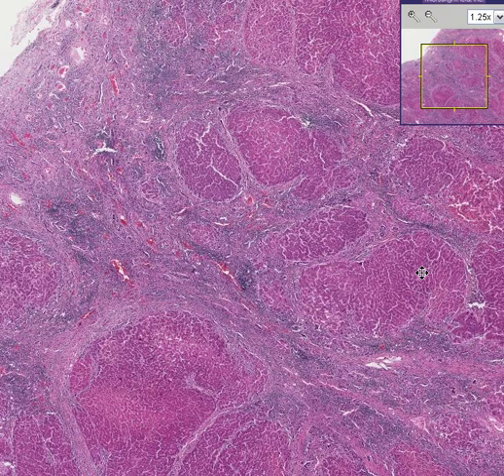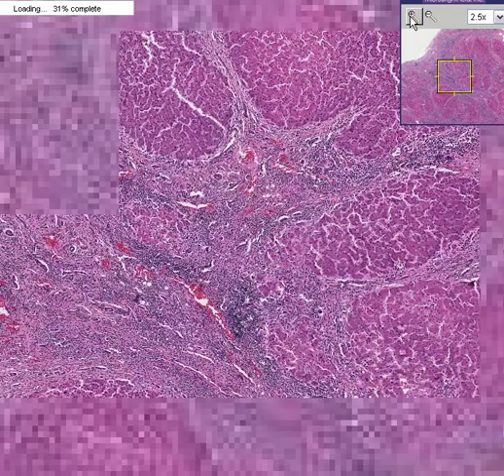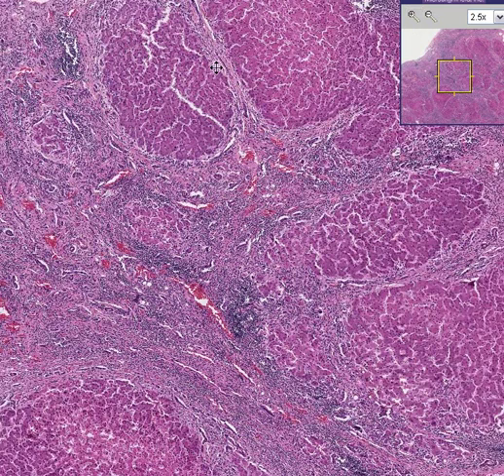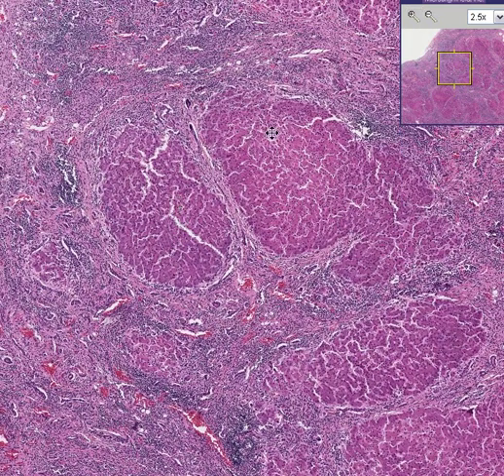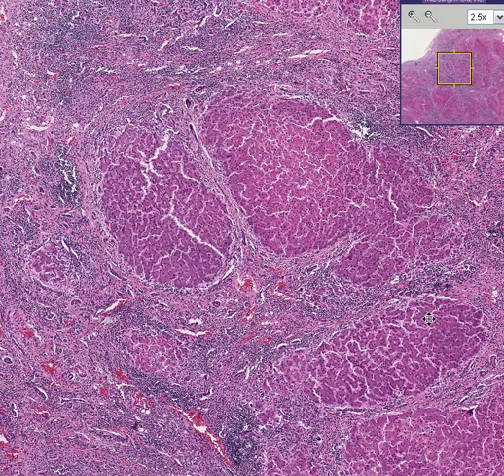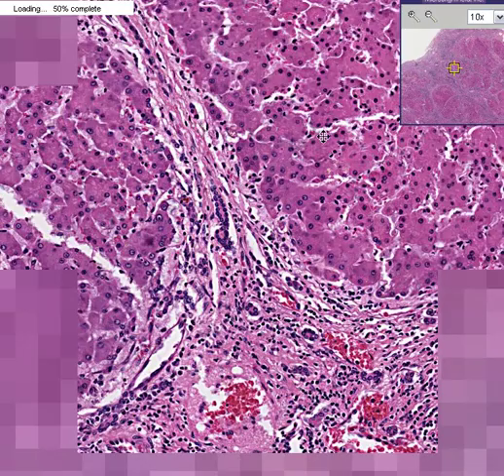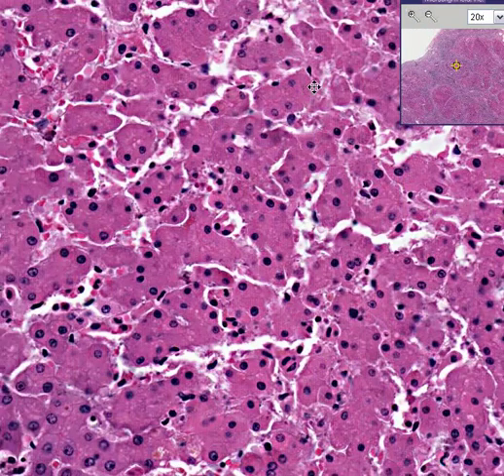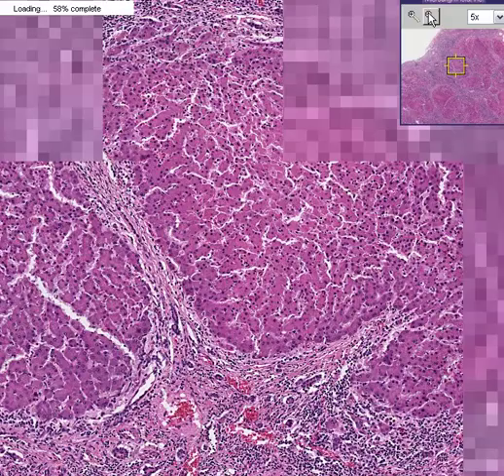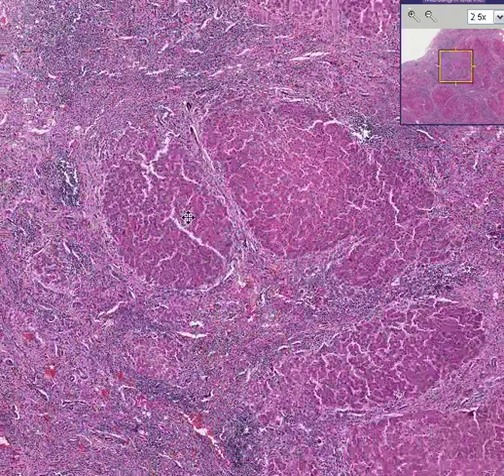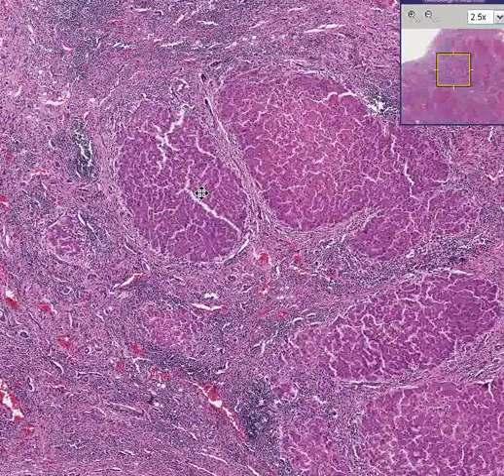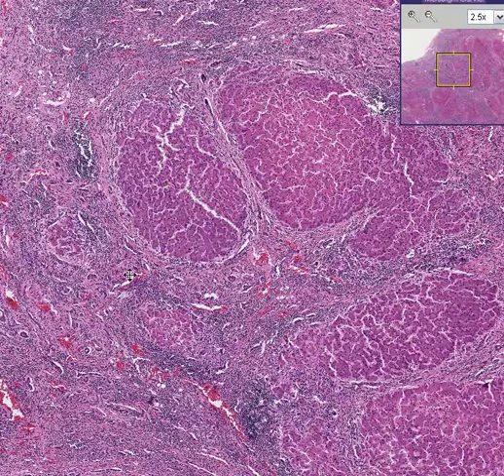You need these two things to diagnose cirrhosis, and because of that, cirrhosis is a low-power diagnosis. Here's a nodule, and here's a nodule, and here's a hepatic nodule — they're composed of cords of liver cells. When you look at these nodules very close up, you may conclude that they look relatively normal. But when you go back and look at them low-power, you can see they no longer have their routine hexagonal arrangement — they are arranged irregularly.